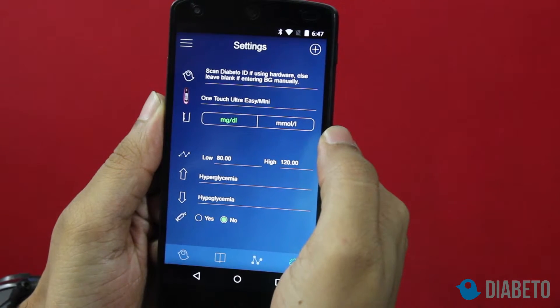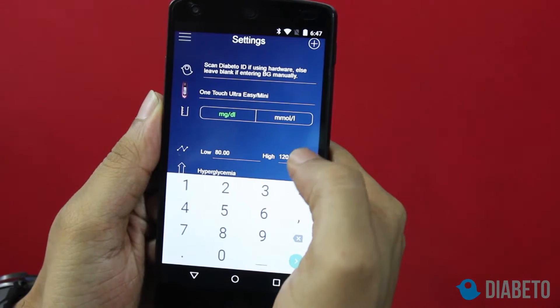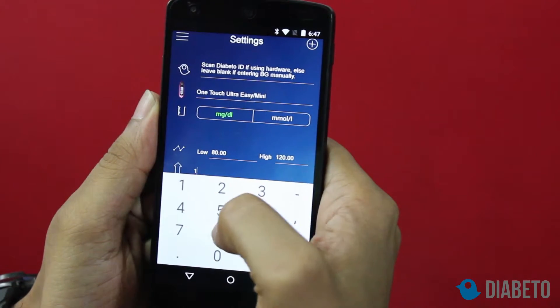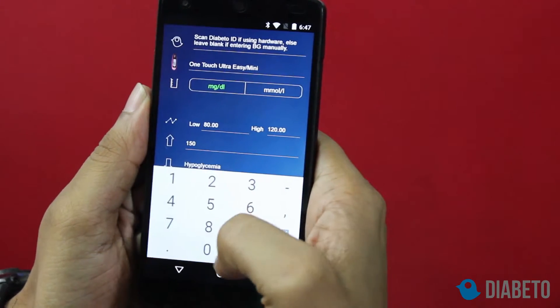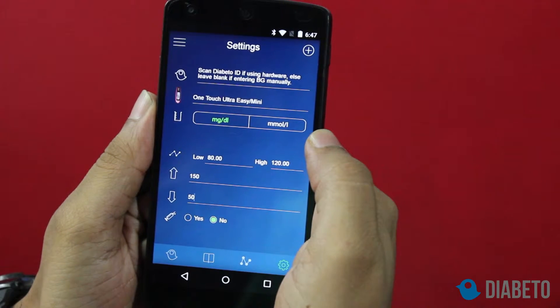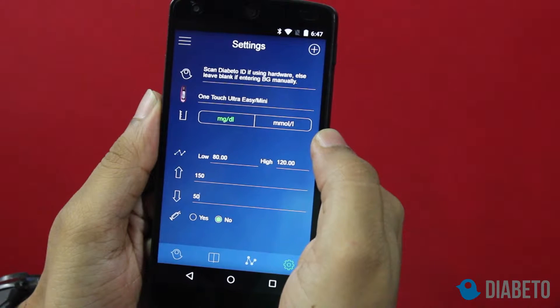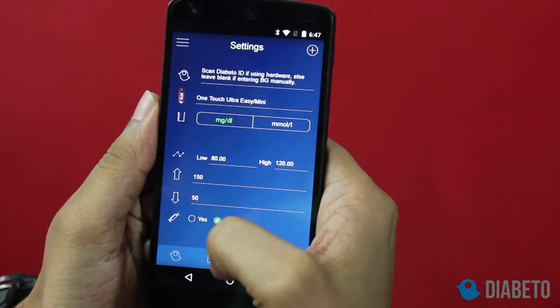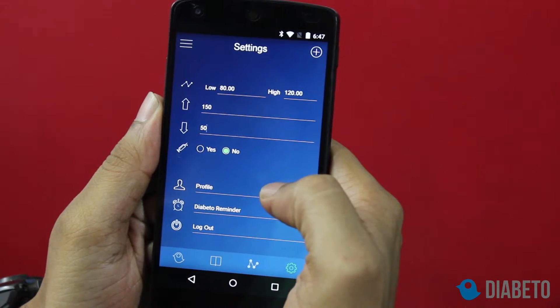The fifth field is hyperglycemia, which is something that will be completely different for different people. For me, hyperglycemia is 150 and hypoglycemia is 50. The next field is insulin — if you are taking insulin in your current diabetes regime you can select yes. I'm not taking insulin right now, so I'm going to select no.